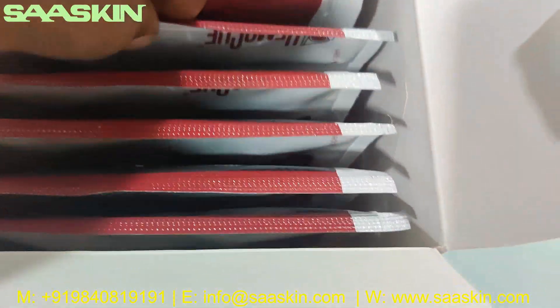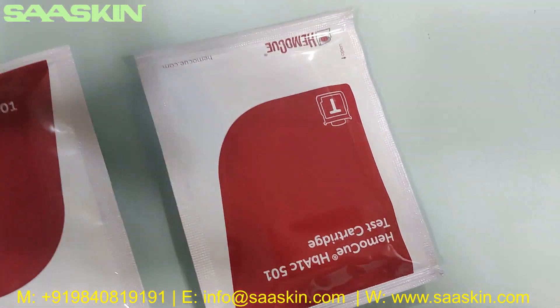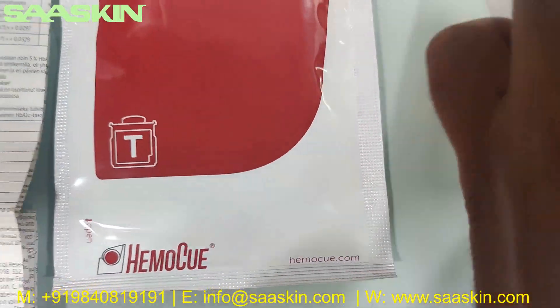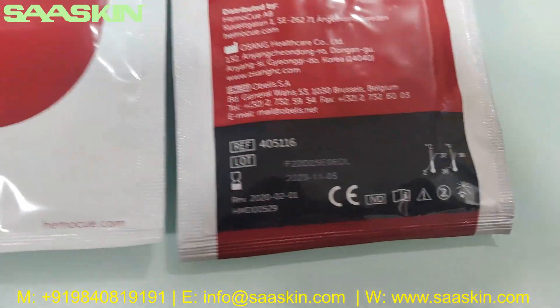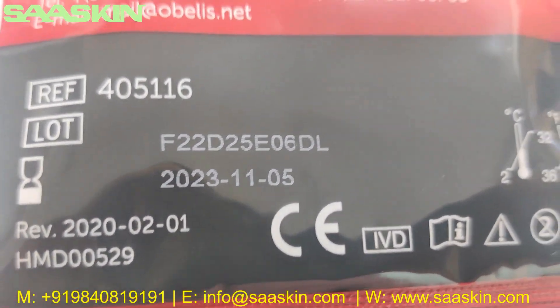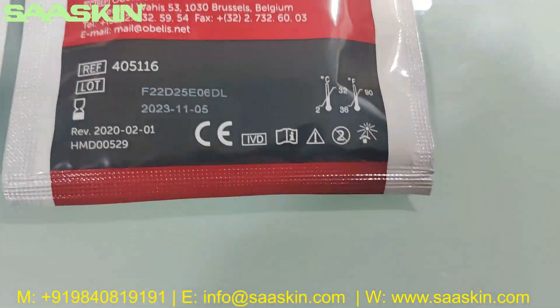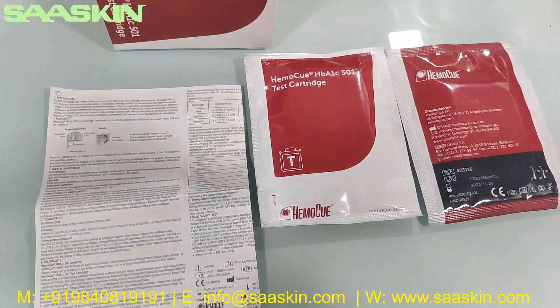Inside you can see the 10 test cartridges. I'll pick two to show you. This is how the cartridges look like — I can show you the other side. I'm showing you both sides. You can see it's CE certified, and here is the reference number, expiry date, and details about manufacturing and distribution. This is how the cartridges pack looks like on a standard kit.